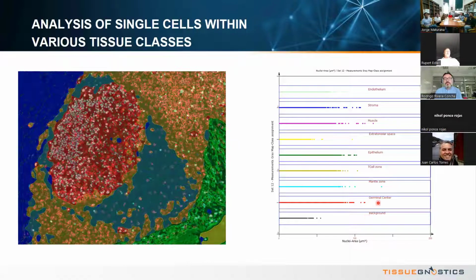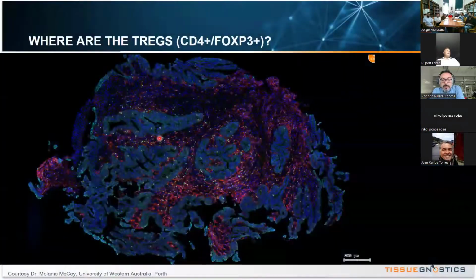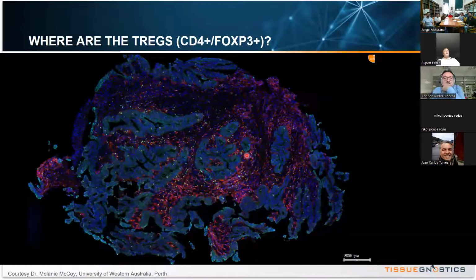And you will get the readout of how many cells of which phenotype are in which of the histological classes that have been identified. So we have seen that we can scan bright field samples, fluorescence, confocal, multispectral, multiplexing, and single cells, subcellular structures, multicellular structures. We can now combine everything and do what we call contextual tissue cytometry. Others call it spatial immunophenotyping.